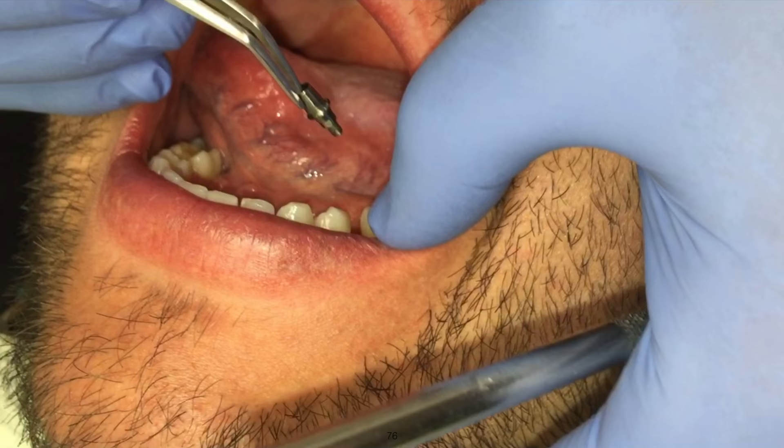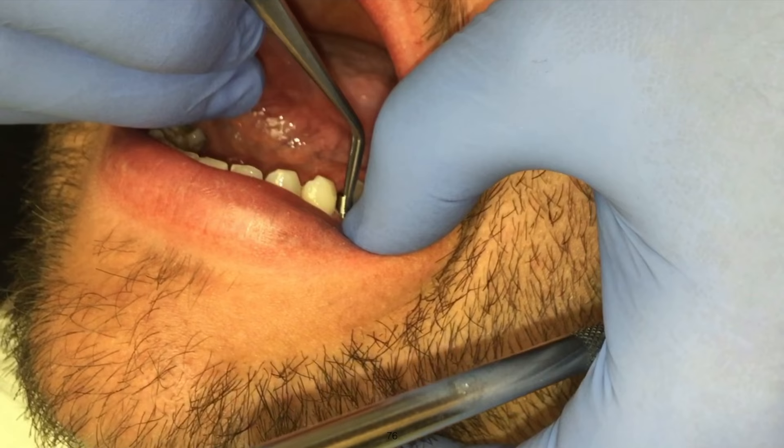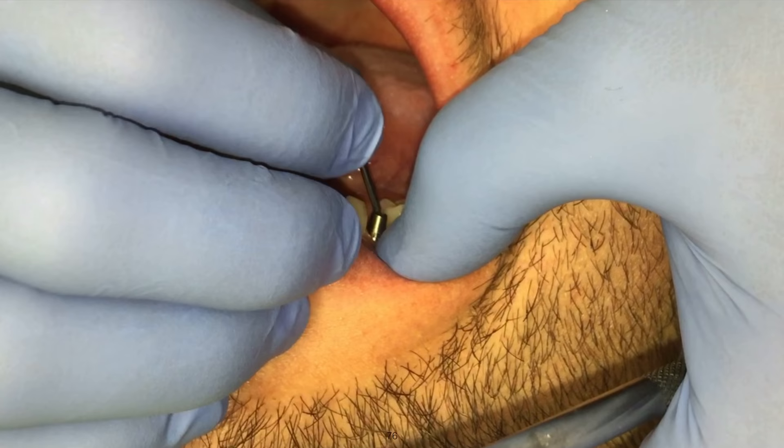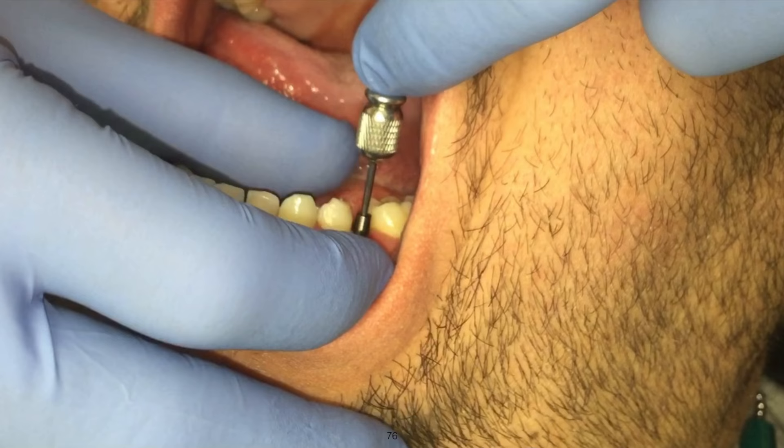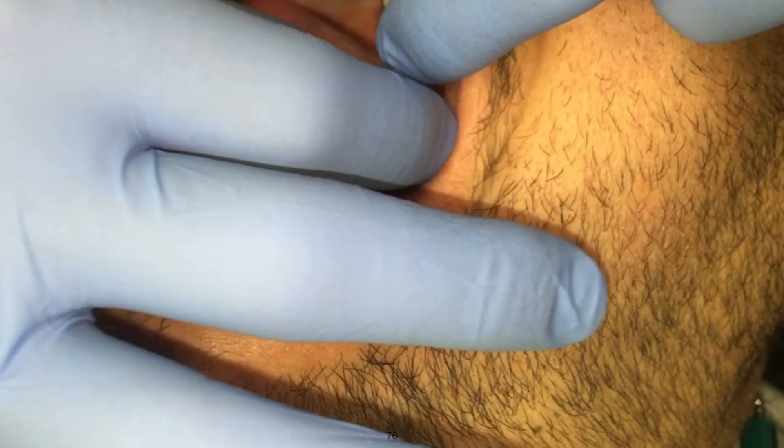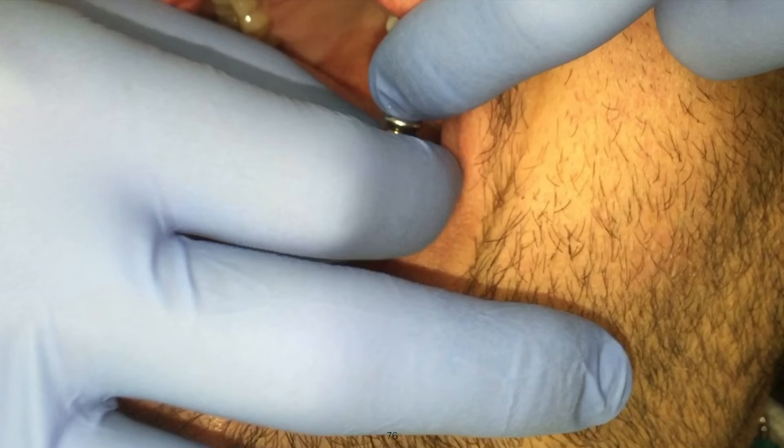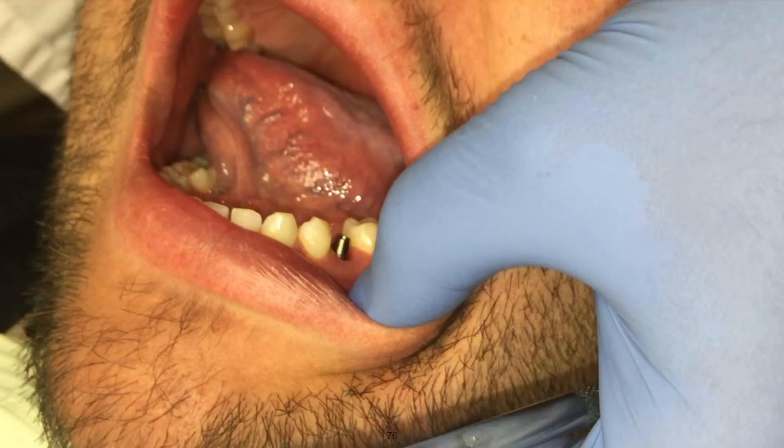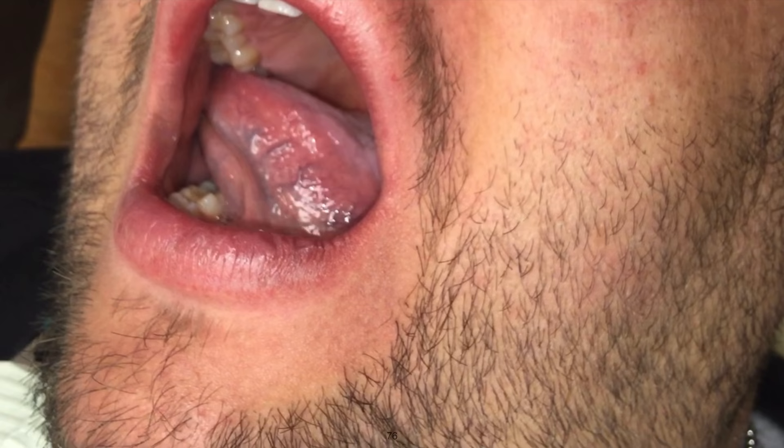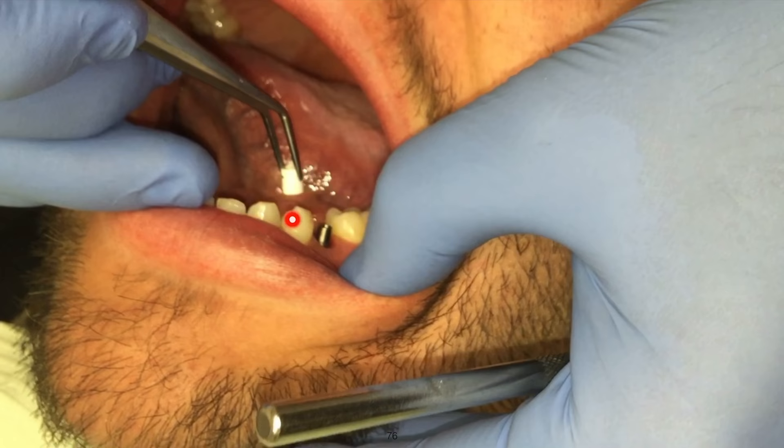The first thing I'm going to do is put the tie base on. You notice that's a tie base, not a scan body. Be very cautious. Internally that implant has a hex, and so the tie base that I'm putting on there has to be oriented correctly. It must lock in the right orientation. Once we get the tie base in place, I would also suggest putting the scan body on because it's no extra work. Put the scan body on the tie base, then get a bite wing x-ray, make sure those pieces are mated correctly.